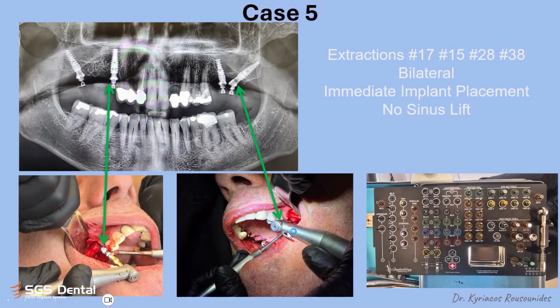Why I'm introducing this: because here I need the longer one. There are sometimes mouths that don't open very wide, or angulations that are not easy to reach. So we sometimes need the short drills if we don't have enough space to work. In this kit, you can also find, in these three parts, the bone profilers that we introduced before, and some of the rescue kits also. This is the beginning of the rescue kit.